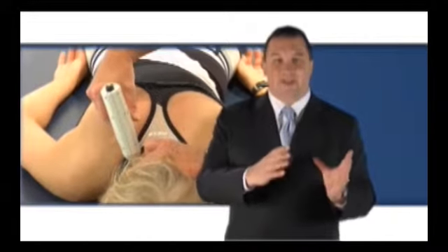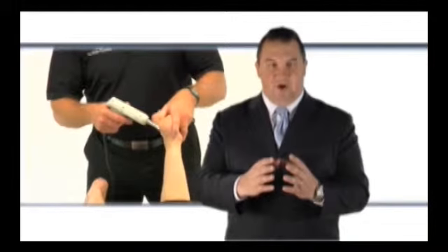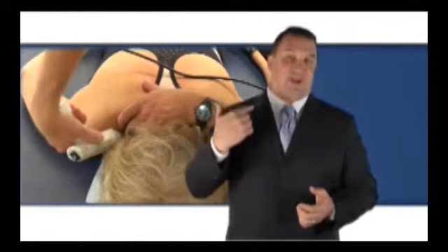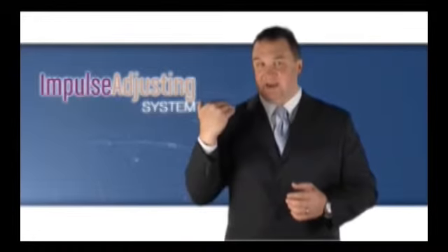Then we show you the clinical protocols that we have developed that incorporate combination adjustments that best target the neurology and biomechanics of the involved anatomy. So with this approach, in a patient with neck and arm pain, for example, you may adjust the C6 facet joint, but also apply our muscle resetting protocols on the scalene and levator scapulae prior to adjusting for a rotator cuff dysfunction, for example.